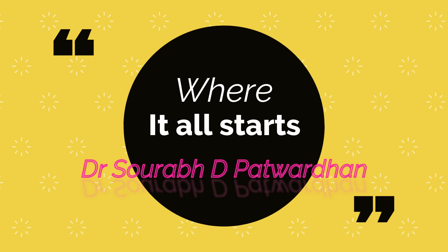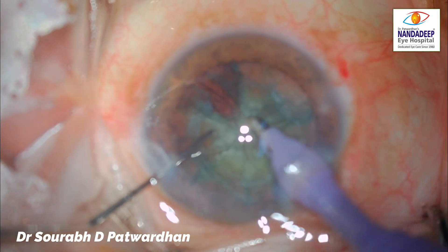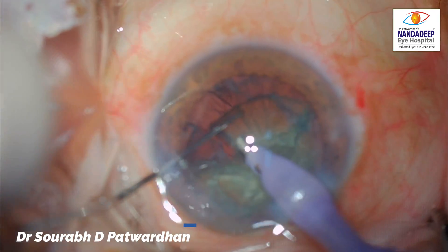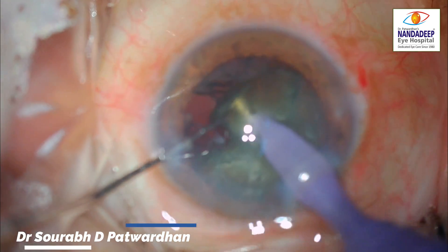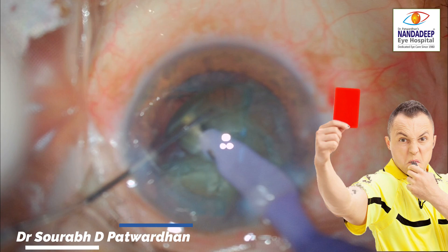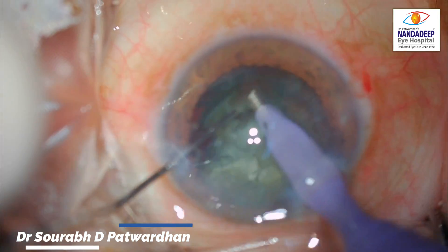Hello friends. In this interesting video I will be speaking about a particular case of a trainee where a complication occurred. This is the second half of the case. The trainee has already divided the pieces but not completely, and he is trying to take out the pieces for quadrant removal. Just look at the feco tip — it is leaving the safe zone quite frequently.